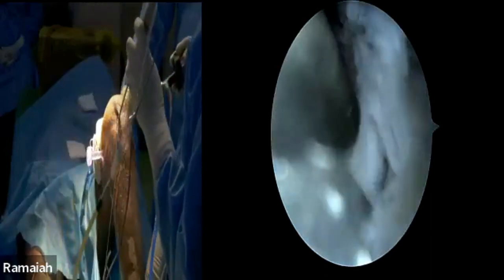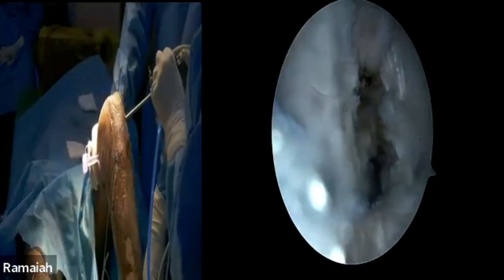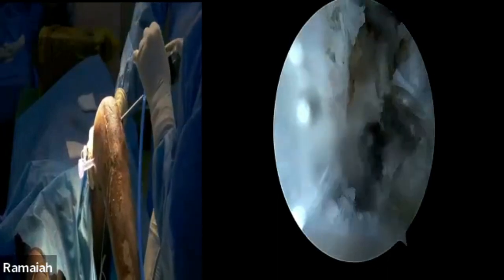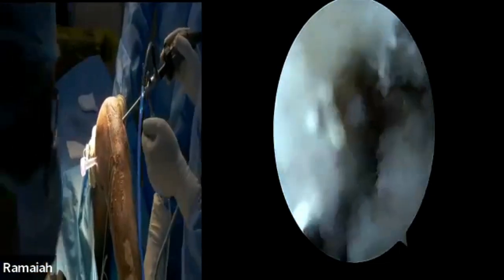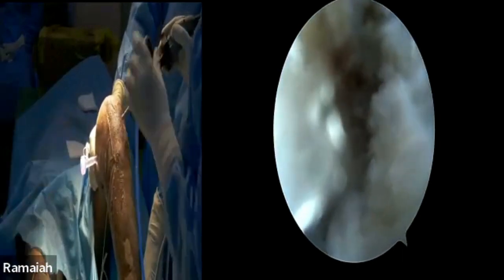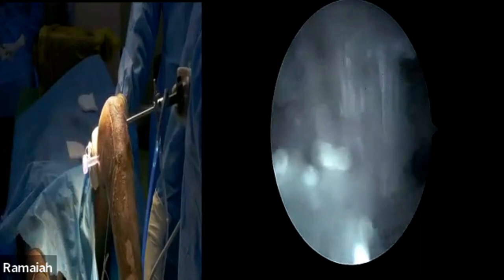Question: how do you enter the scope through window one past the posteromedial capsule? Answer: the femoral condyle is here and window one is between it and the PCL. You enter with little controlled force between the PCL and the condyle and you land in the posteromedial gutter. When the ligament is too bulky, as in this case, you may need window two for suture management, but here we'll manage from one portal.